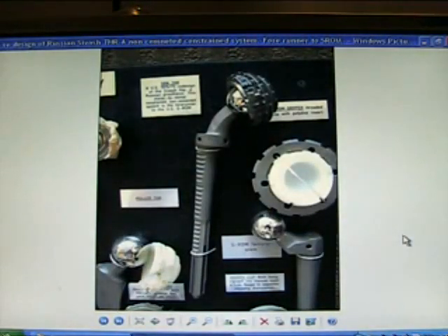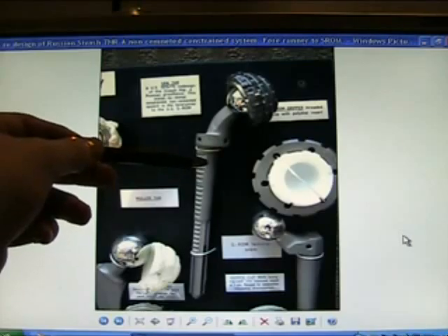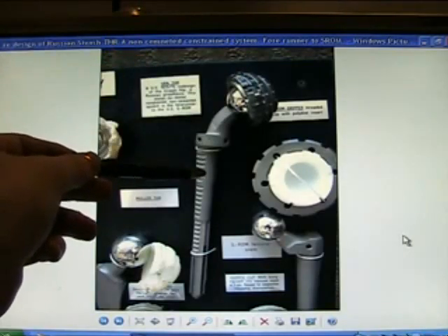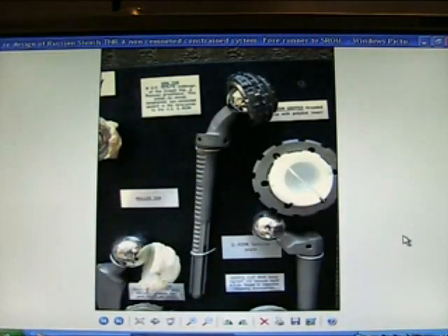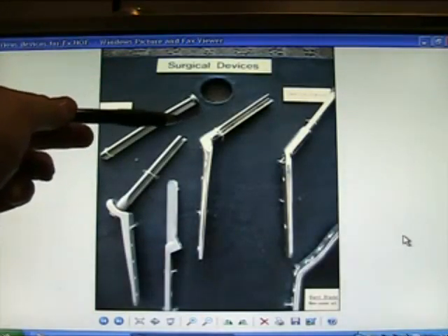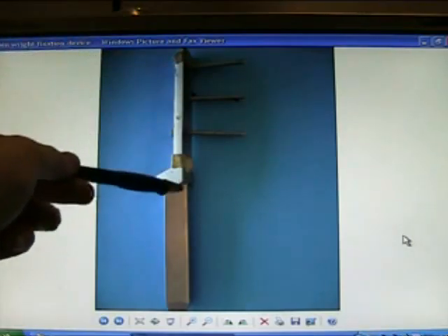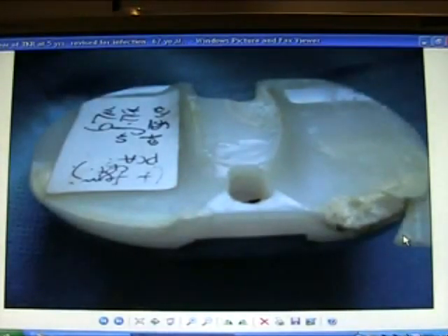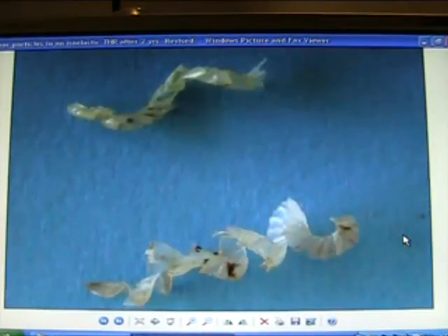Here's a US design of the Sivash hip — a Russian surgeon, Sivash, designed this hip replacement, a very good design. It was redesigned by the Americans into the Sivash and then came out as the S-ROM. Various devices for fractured neck of femur: a Wainwright fixation device. We have a tibial component knee replacement again at five years.